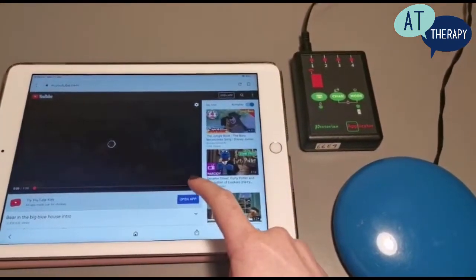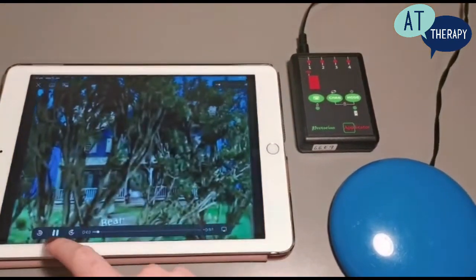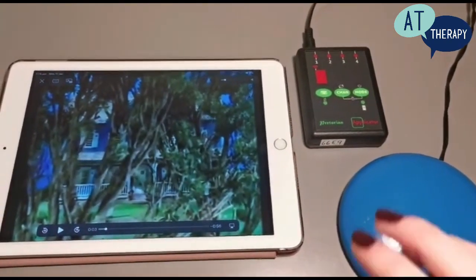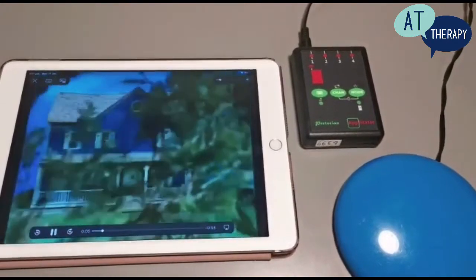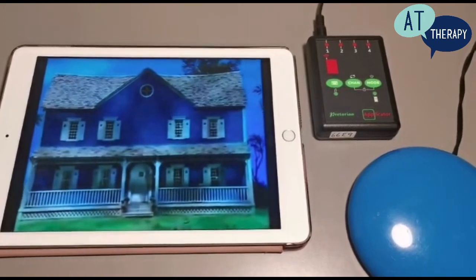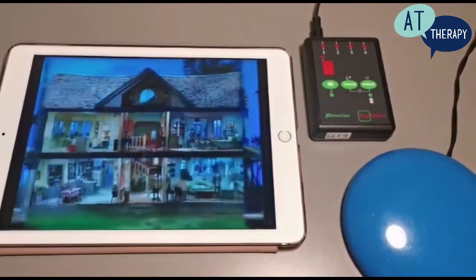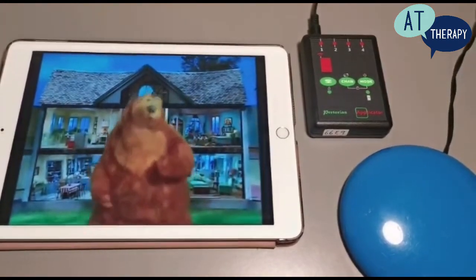We are going to make the screen big and we are ready to press the switch to play the music. So in this mode when the switch is pressed it will play the video or the music for 30 seconds before stopping. This is when we need to press the switch again to play the video for a further 30 seconds.